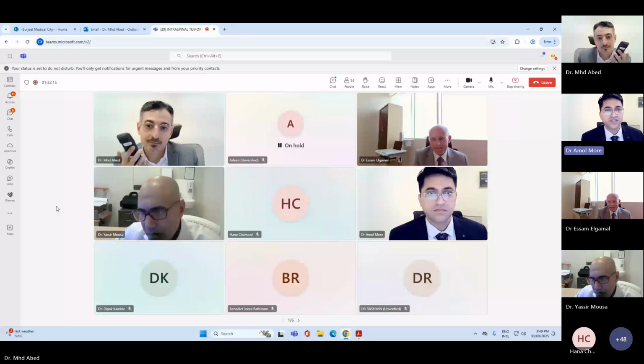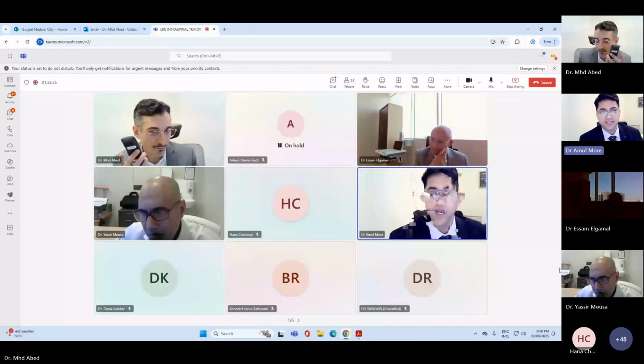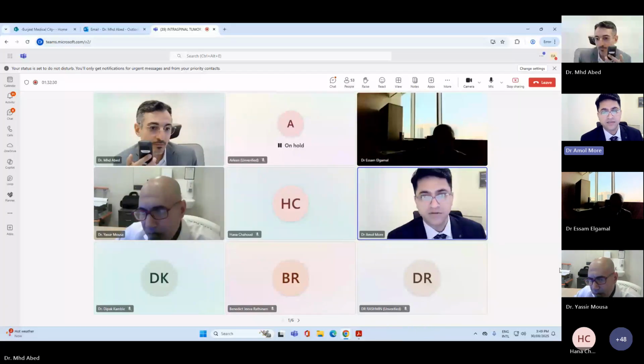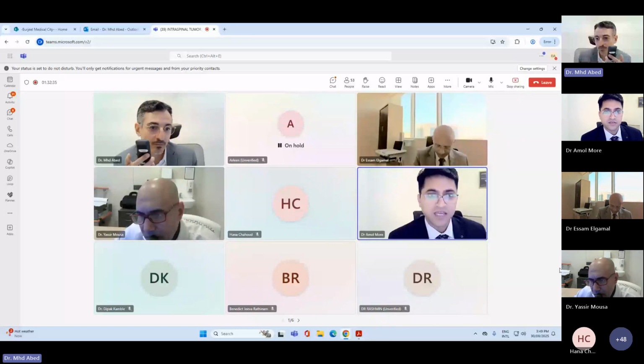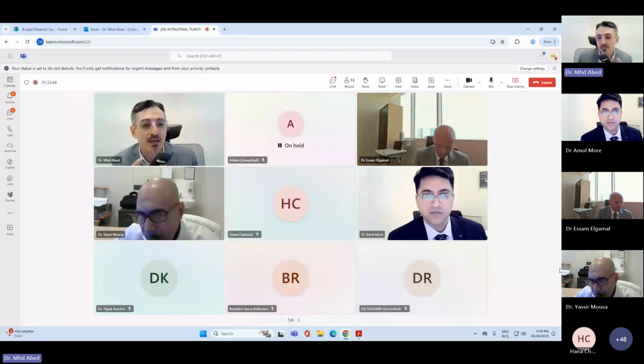One more question, Dr. Adil. Is there any role of dynamic post-contrast imaging in such tumors? Because recently I got to know in one of the articles that people are doing dynamic post-contrast as well. Yes, if we have a lesion which is related to a dural fistula, or an arteriovenous malformation, the dynamic sequence is important to see the inflow and outflow.